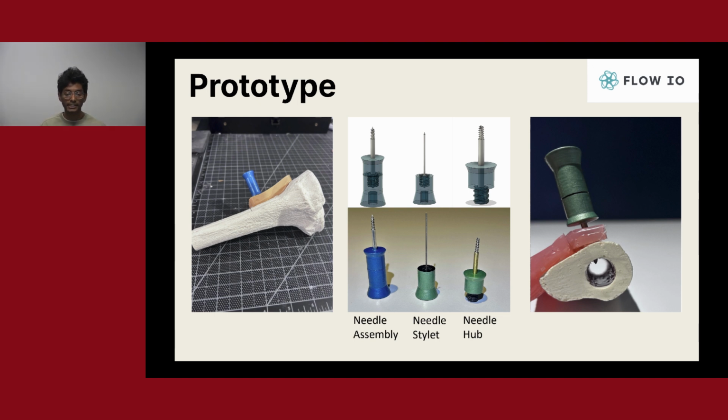The whole needle assembly is drilled into the patient's tibia via a hex bit and drill. Once the needle is in the IO space, the mechanical shoulder will stop you from drilling further, and you can remove the stylet component. This will leave the needle hub connected to the patient. Infusion tubes are connected by a luer lock to the needle hub, allowing for fluids to be dispensed to the patient. Because of our design, utilizing the shoulder to prevent extravasation, the amount of soft tissue a patient has does not make the needle unsafe or require additional sizes, unlike current needles on the market today.